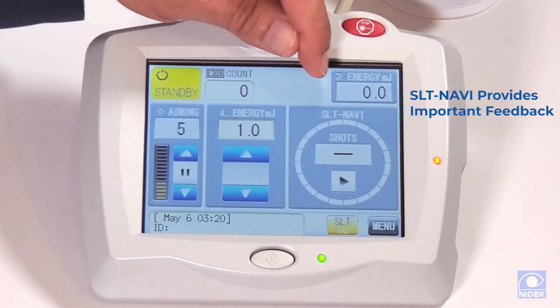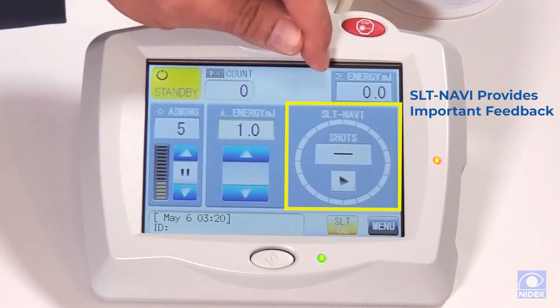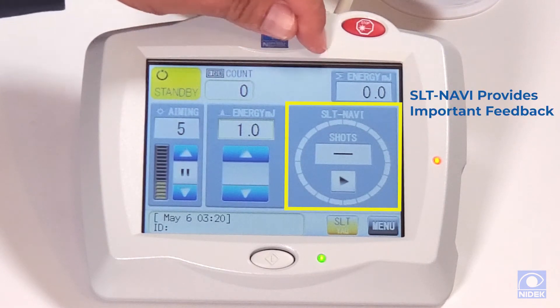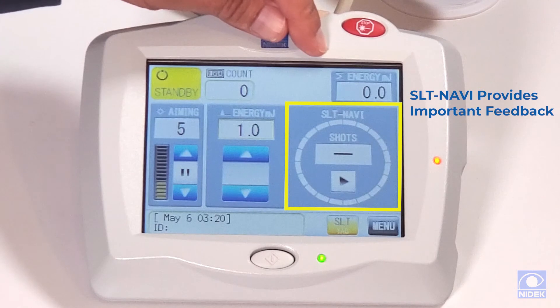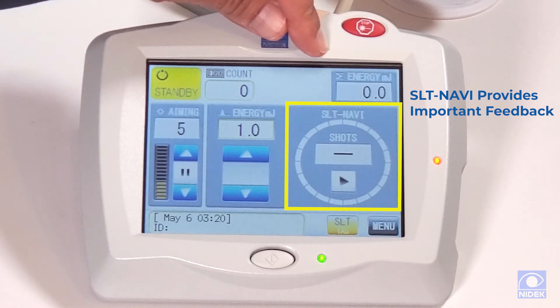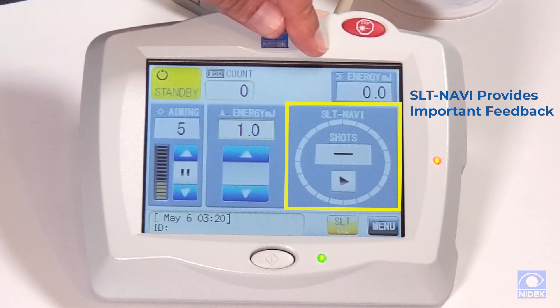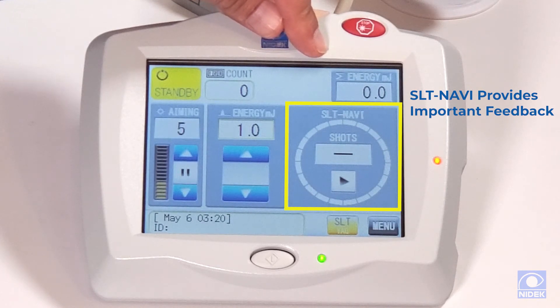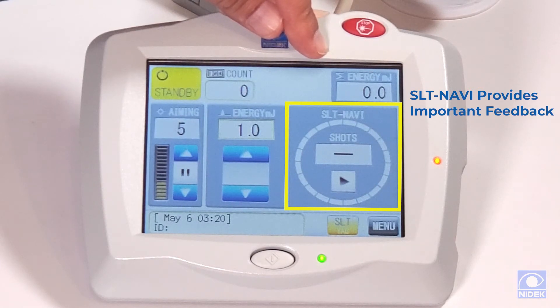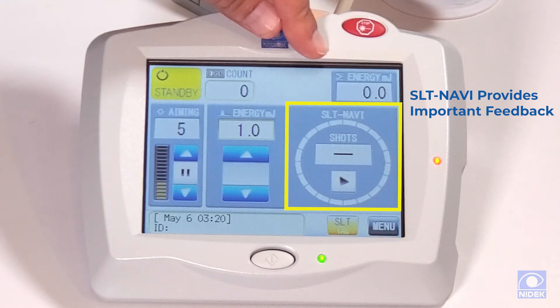We also have this unique feature called SLT Navi — it's a navigation tool. It's nice to have because it navigates and shows the doctor where they've been treating during the procedure. If the patient gets up or moves, the doctor can put the patient's chin back in the chin rest and safely know where they left off in their treatment.